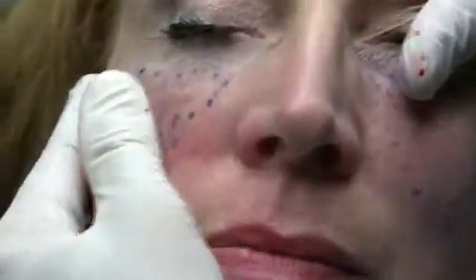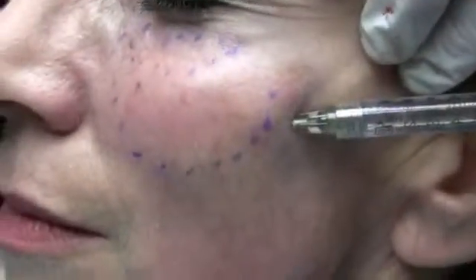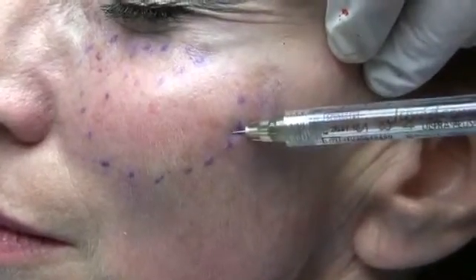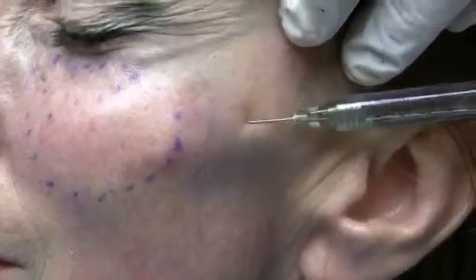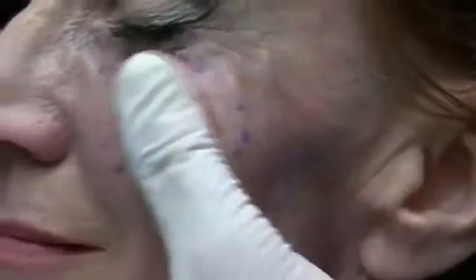So we'll go back and we'll massage all these areas, and I think it's very apparent the positive changes that we've made. So now in finishing the contour of our cheeks, we're going to taper out over the lateral zygoma a little bit, and this is what the patient will notice when she looks in the mirror. She will appreciate that little prominence, because if you don't have this, or if you had it in youth and you don't have it now, when you restore that, it becomes very apparent to the observer.